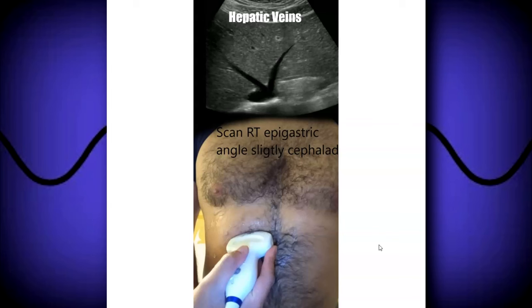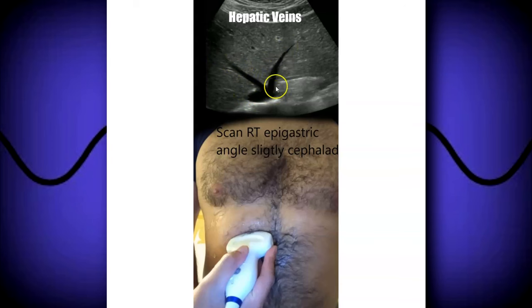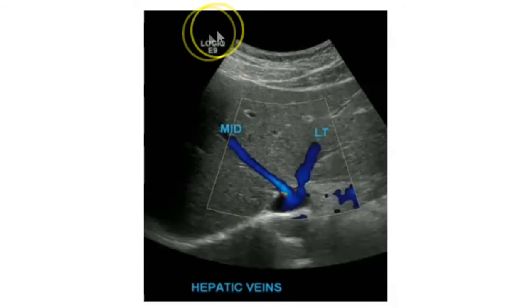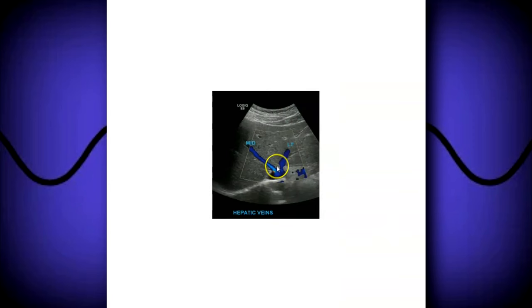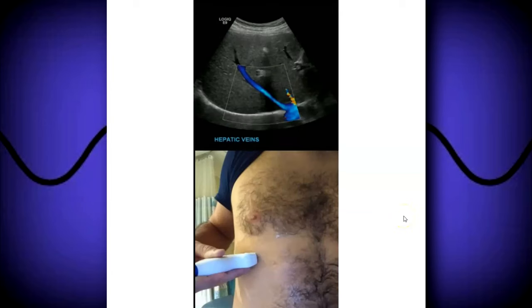Once you're done with the IVC, move on to the hepatic veins — there are usually three of them. At the same level, go transverse and angle slightly cephalad and you'll see what's called the playboy bunny sign. You have your left hepatic vein, middle hepatic vein, and the IVC. With color Doppler you can see the left, middle, and right hepatic veins. In some patients you can see the right hepatic vein in the same image; in other cases you may need to angle laterally or scan through the ribs.